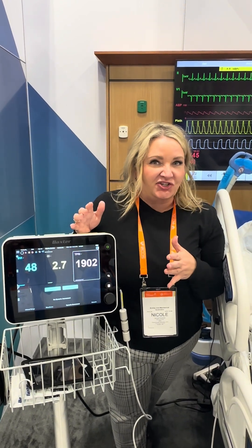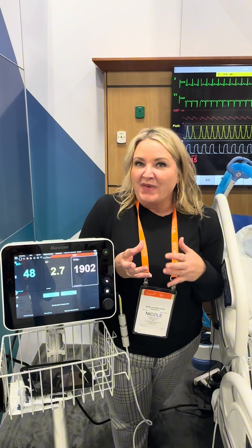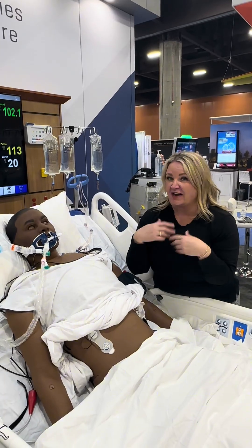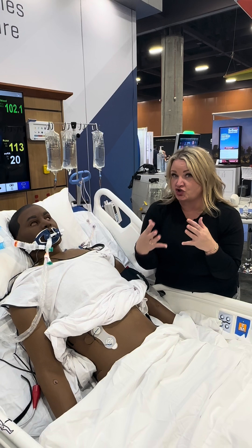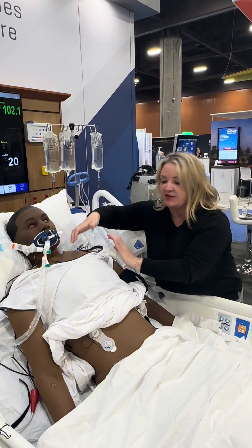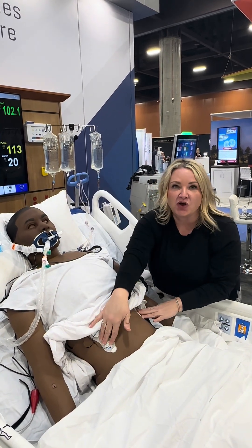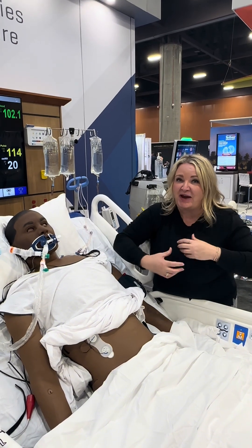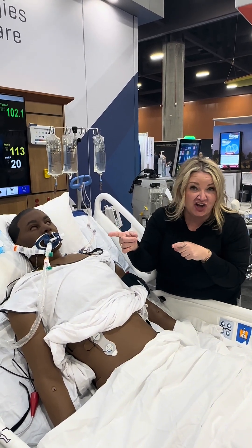To answer that question, we need to measure some sort of a stroke volume measure, and we're going to pair that with a passive leg raise test. So now we're going to non-invasively measure the patient's stroke volume. We've placed patches above the heart and below the heart, basically making a box around the heart, and in two phases the patient's stroke volume is going to be calculated.